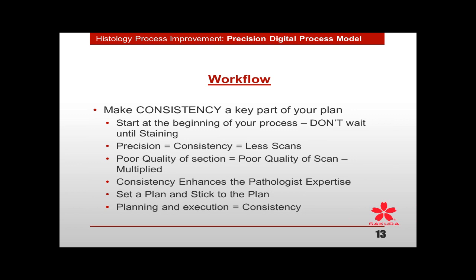Remember, poor quality of our section, and I'm not saying that it's a quality that pathologists can't adjust and make a diagnosis for, becomes more difficult as you add in the digital images because now they're seeing an even more enhanced image of that glass slide, and it creates more questions.